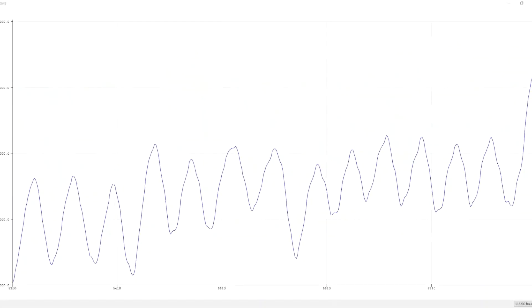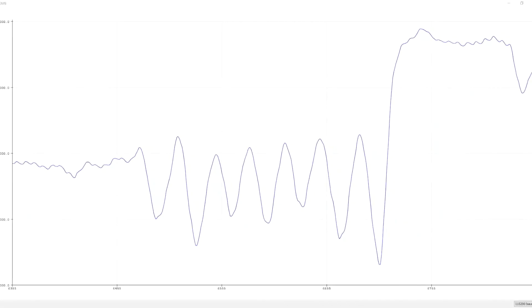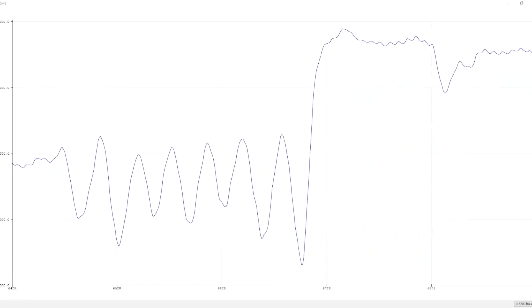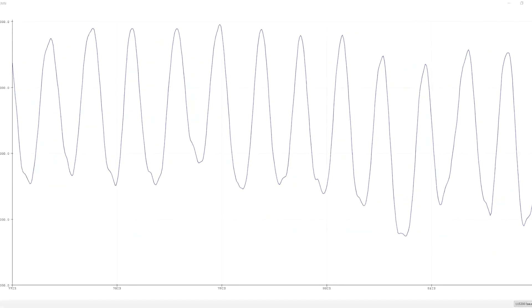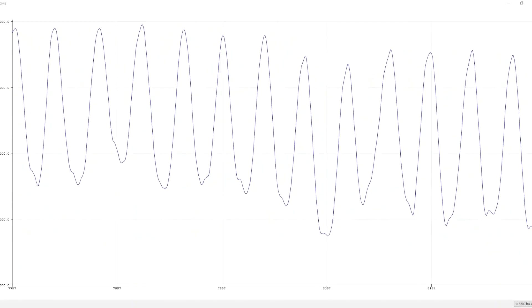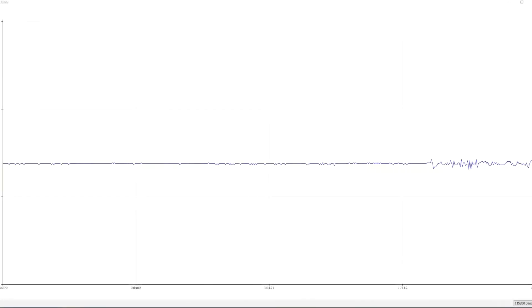Here are the measurement results from each sensor. For the pressure sensor, during normal breathing it shows a regular wave pattern. When we try to hold the breath, you can see a threshold difference in several places, showing a clear difference between someone who is breathing and someone who is not. For the acoustic sensor, during normal breathing there is a small wave indicating the person is still breathing.